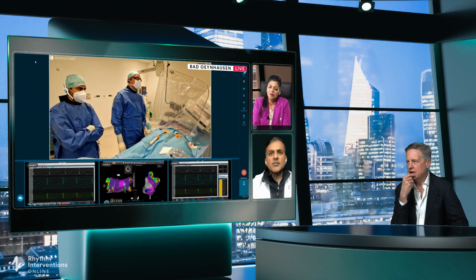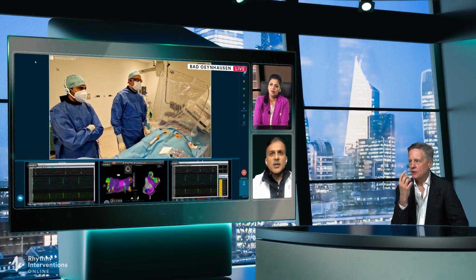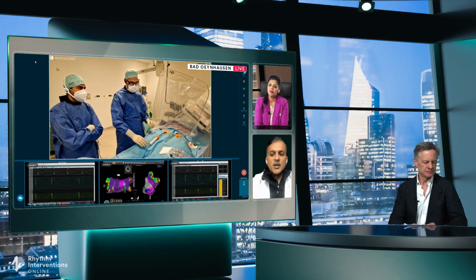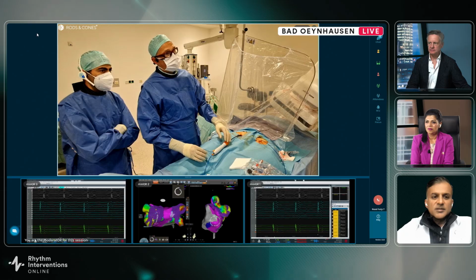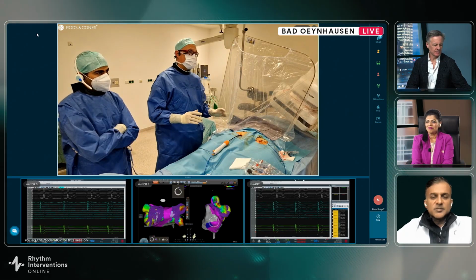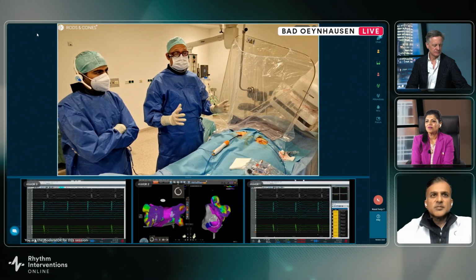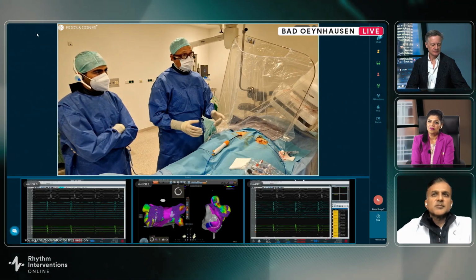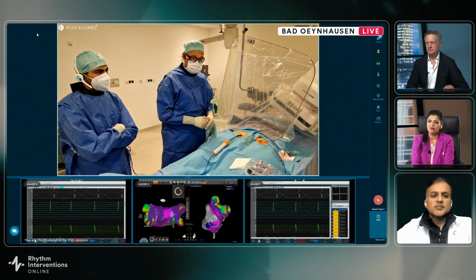Do you just go around the whole vein again, or can you track where the break is, or what's your approach here? So I always check the osteal area first of all. Whenever I do a repeat procedure, also with a ref, we look where is the pulmonary vein ostium. We try to mark it. Therefore, we use imaging in the majority of cases.